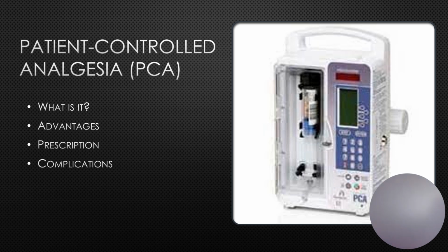Occasionally, there's going to be an order for a bolus dose if the client has what we call breakthrough pain. In other words, the normal dosages are not controlling the pain sufficiently. The client should be the only one to control the button to deliver the analgesia. However, at times the nurse may do this. For example, I would hook up a PCA to a fresh post-op client while they were still in recovery, and because they're not fully awake but they are requiring pain medication, I would push the button for them. This can include an authorized agent-controlled analgesia administrator. This could be a nurse, a parent, or a caregiver, but those caregivers, the parents, will require education.